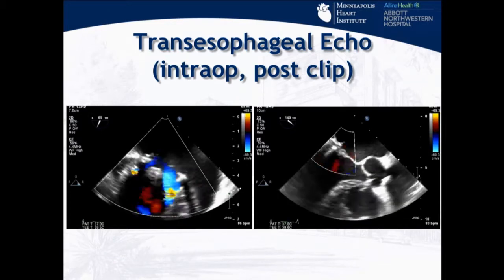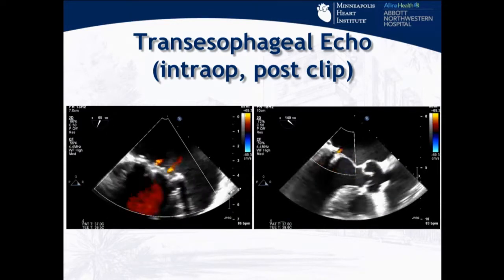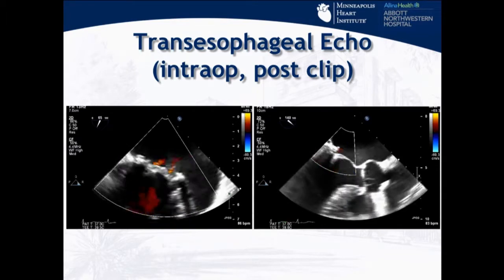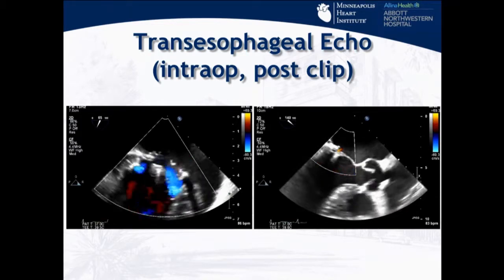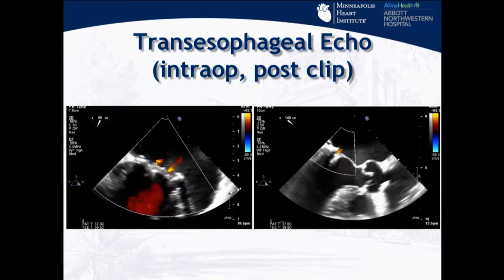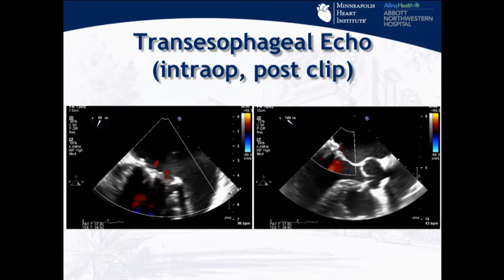So is it stable after that? I mean, what is it actually holding on to? The annuloplasty ring and whatever tissue there is there. So Paul, have you ever just taken one of these and closed it on a ring just to see what it looks like when it closed? Not grossly. It'd be interesting to see. I mean, the radial force, or whatever force it is, it's actually really impressive. You cannot pry these clips open. It's really strong. So. Impressive result.